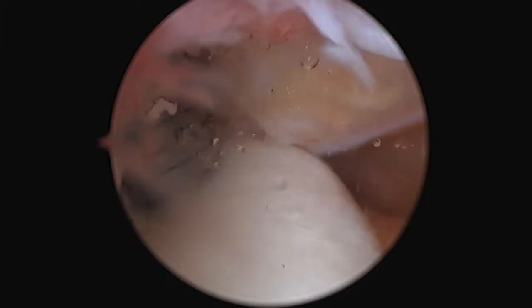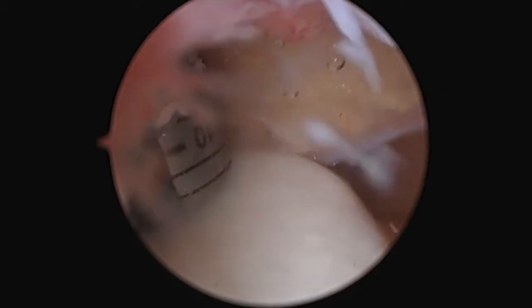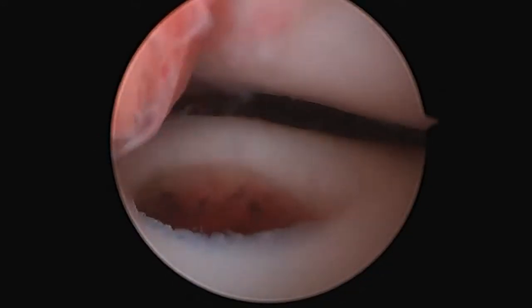Here I am harvesting from the trochlea edge a donor plug consisting of bone and cartilage. This is all done arthroscopically.